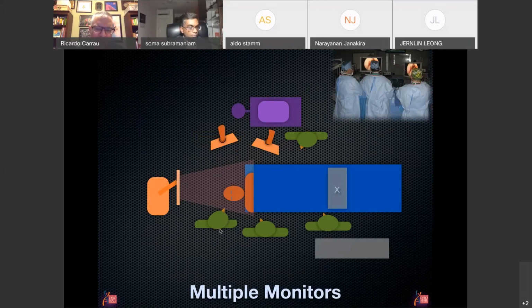You can see here that our scheme is to have the 2 surgeons, where Danny Prevedello and I are both right-handed. We have more or less the same body habitus, and so we can accommodate ourselves on the same side of the patient.